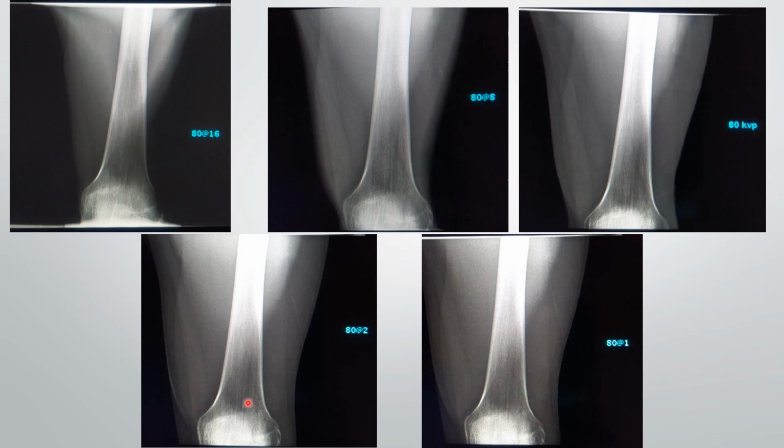Let's look at some images with the mAs changing. Okay, so we can see the different techniques here. This is 80 at 4, all right, and then we double the mAs here, and we double the mAs again, all right, and here we halve the mAs, the 80 at 2, and we're halving it again at 80 at 1. So depending on what is desired, it depends on what is an acceptable image, okay.